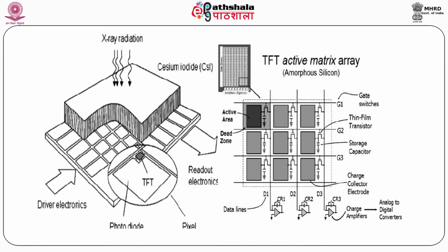Another precaution is that the exposed plate must be read out as soon as possible, because otherwise some fading will take place. Some of the excited electrons might get back to the valence band.